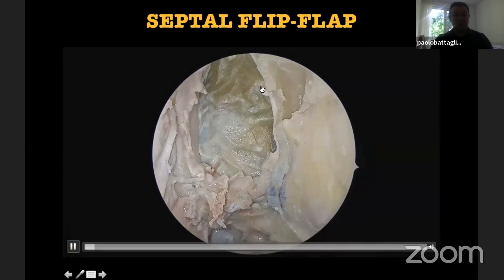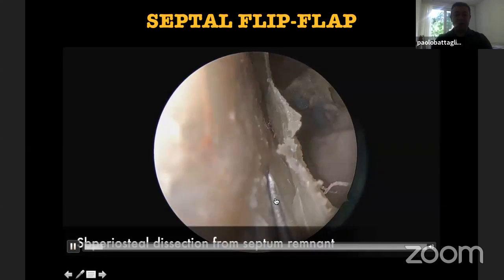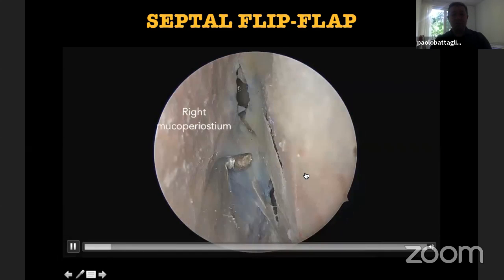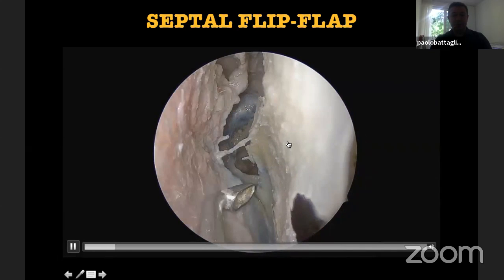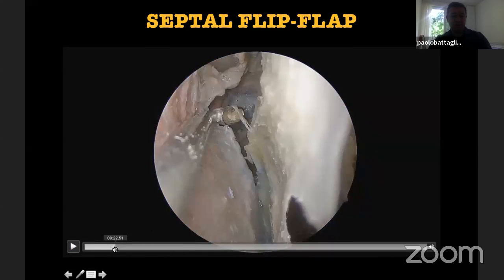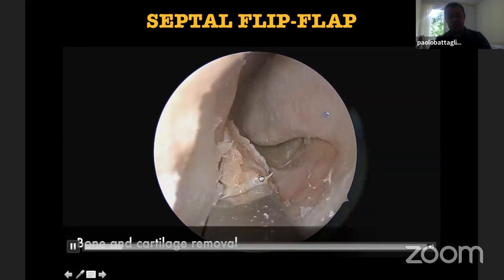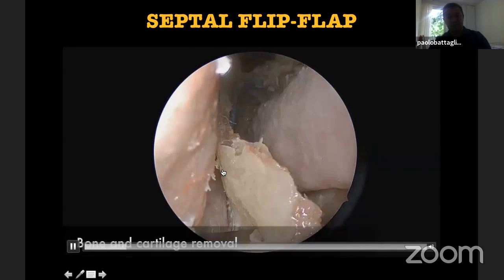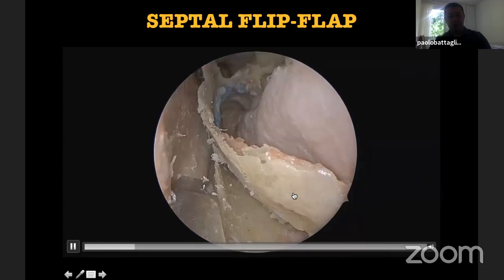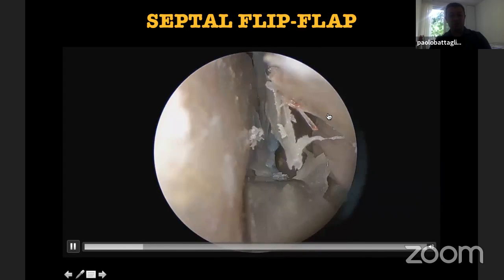You can see we put some fascia covering the brain and between the dura and the bone. And then you see we removed the mucoperiosteum of the left side. We are on the left side and we are removing the septum and the mucoperiosteum of the left side. This is the bony part of the septum, and we remove all of it down to the floor of the nasal fossa. Here posteriorly, we have the sphenoid sinus opened.